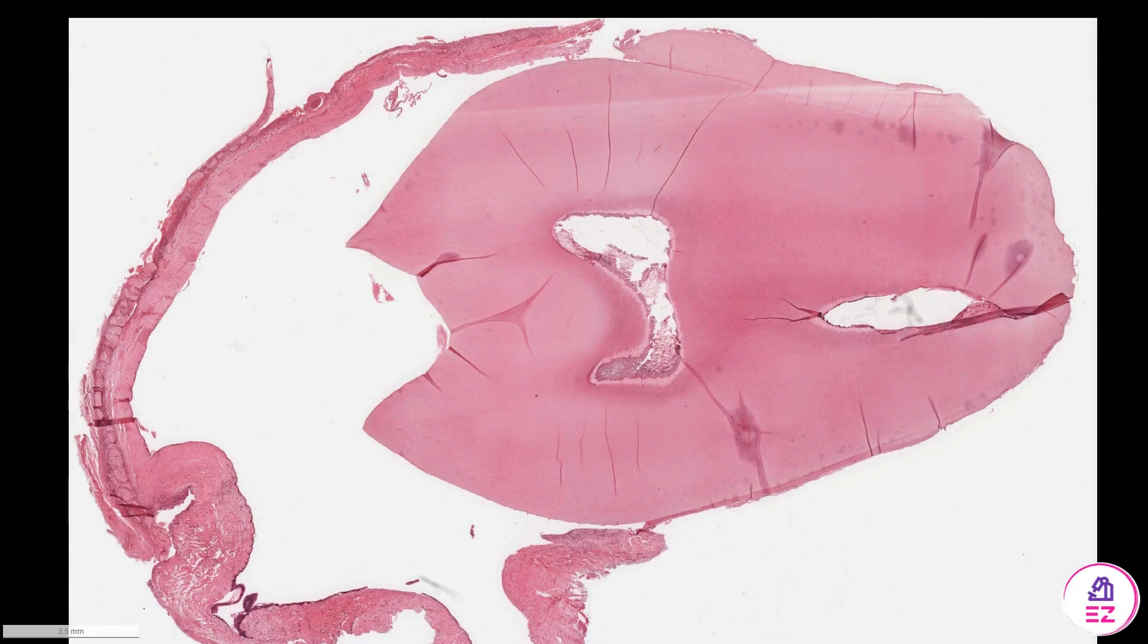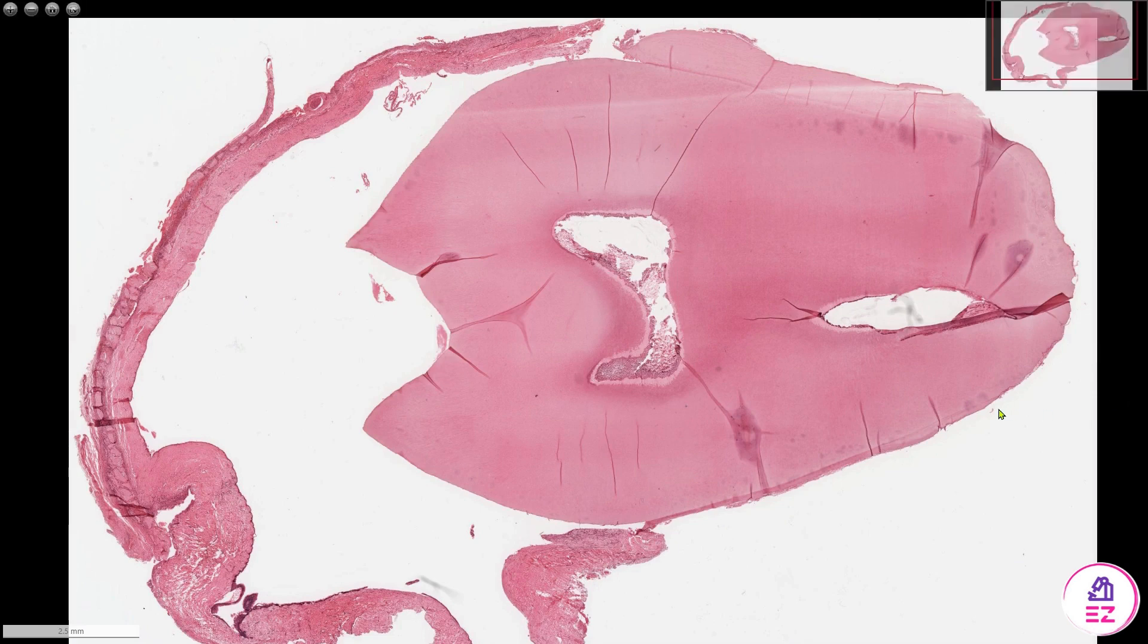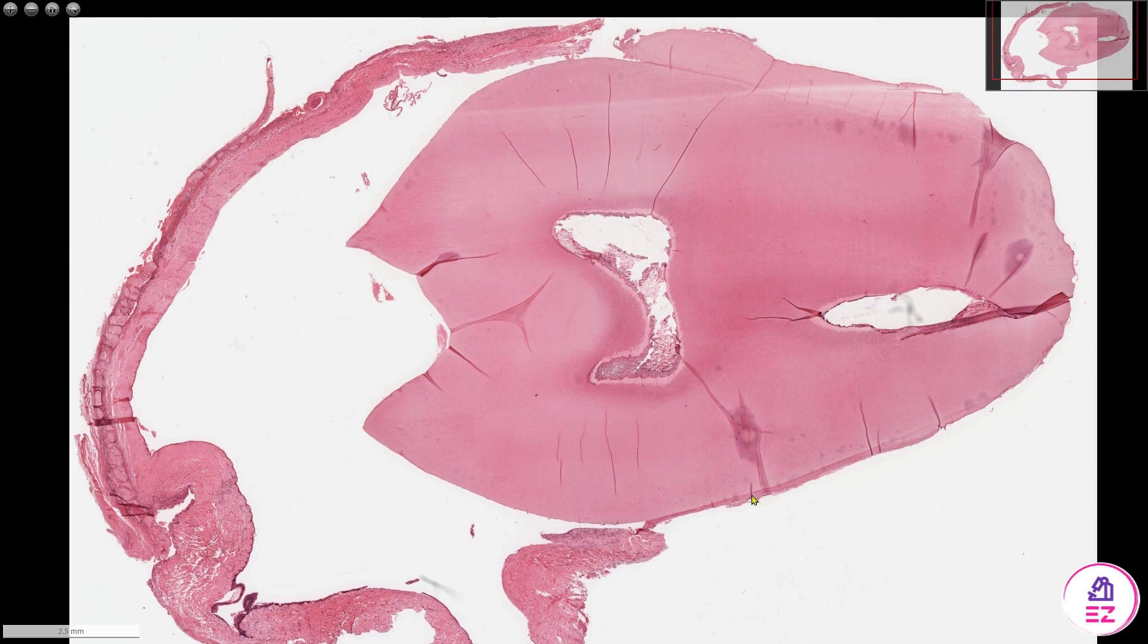Hello and welcome to Path Made Easy. Today's example is a dentigerous cyst. Now quite helpfully, this dentigerous cyst has been removed intact with the associated tooth. Often we're not as lucky as that, but that's what makes this such a nice teaching case.